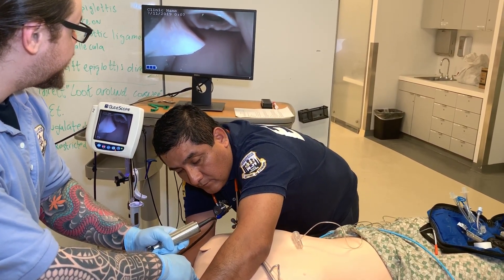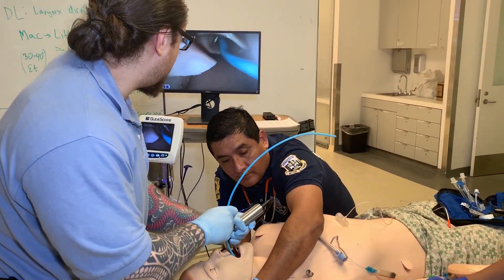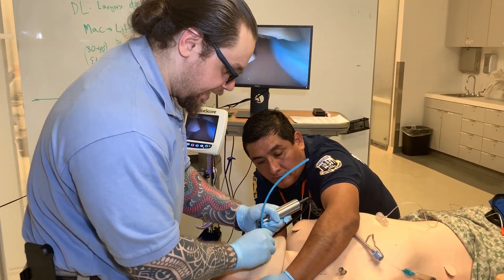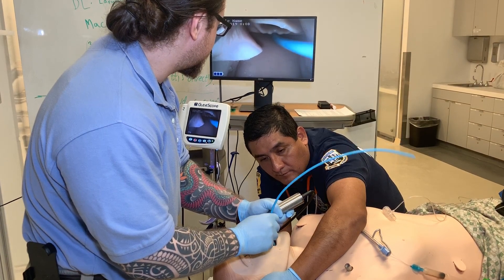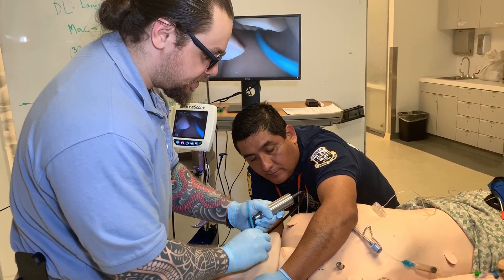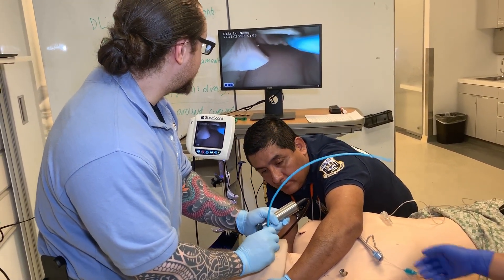I'm applying some external laryngeal manipulation (ELM) but my view is not great, so we're going to utilize an elastic gum bougie — also called an endotracheal tube introducer. When you're in the trachea, you may feel tracheal rings, but the best confirmation is hold-up: you get resistance at the main stem bronchus and cannot advance further — that means you're on trachea. If I inadvertently place it in the esophagus, you can see it goes much further down without hold-up, so I'll withdraw and re-engage until I have hold-up and confirm correct placement.